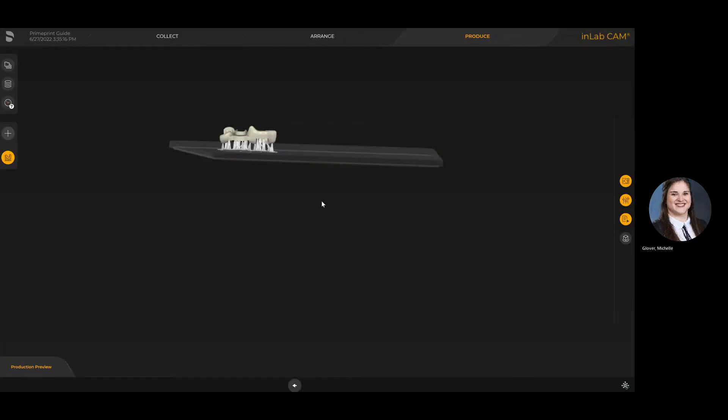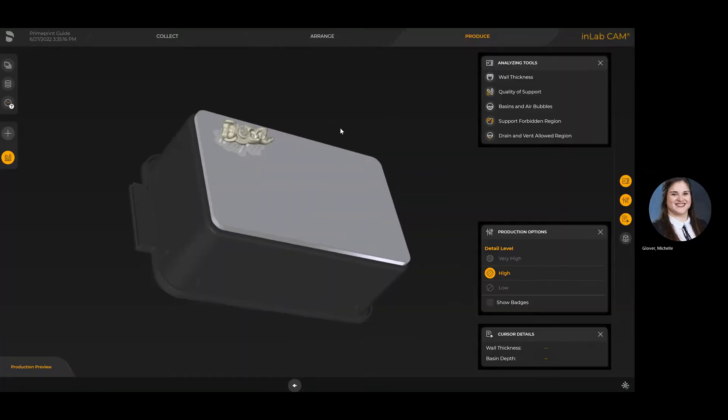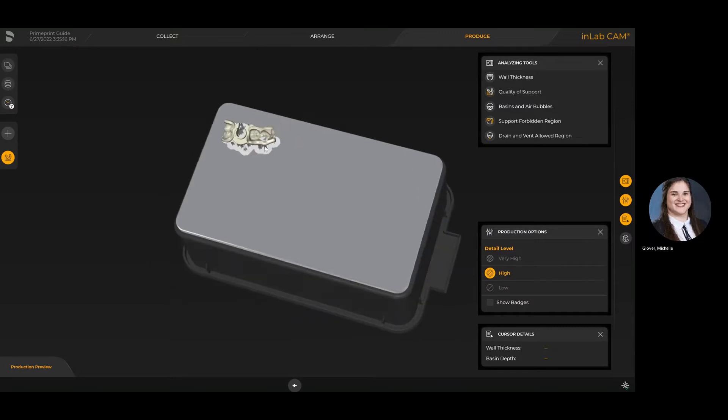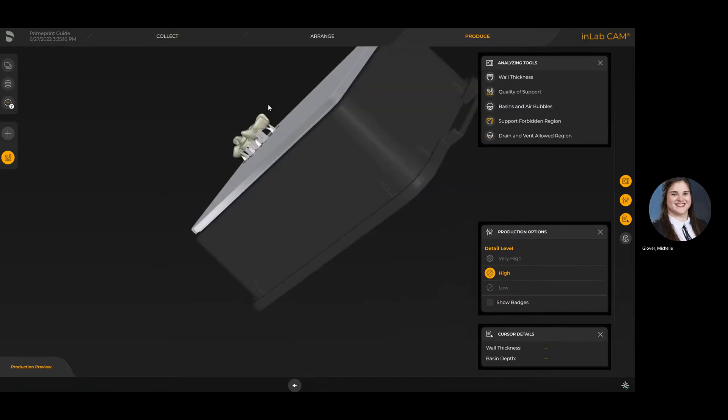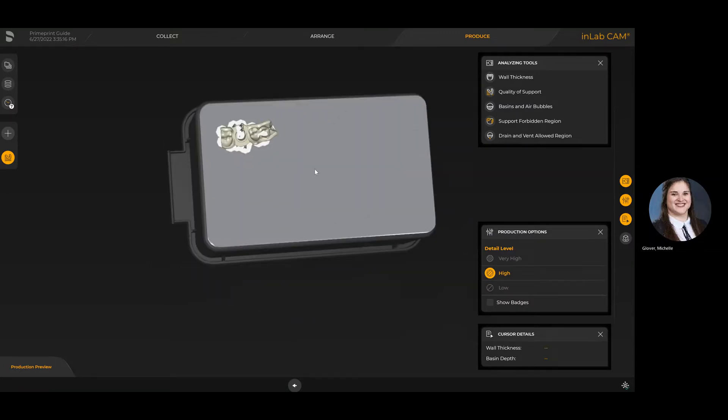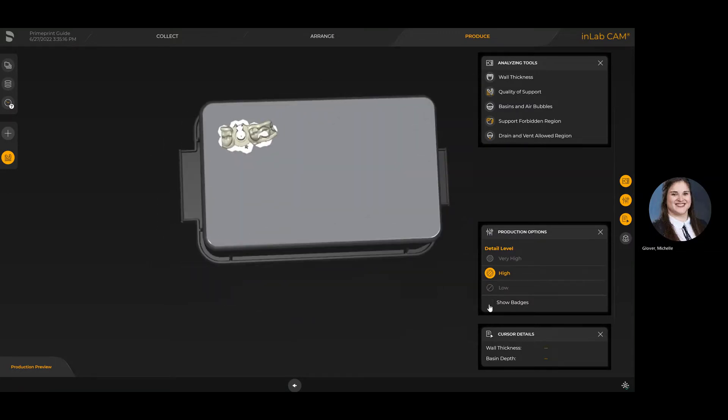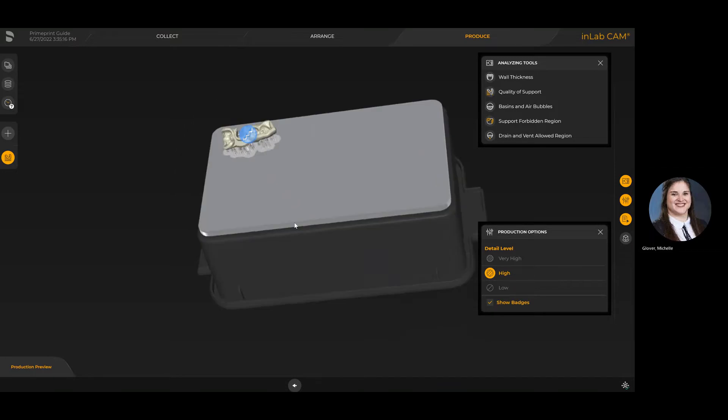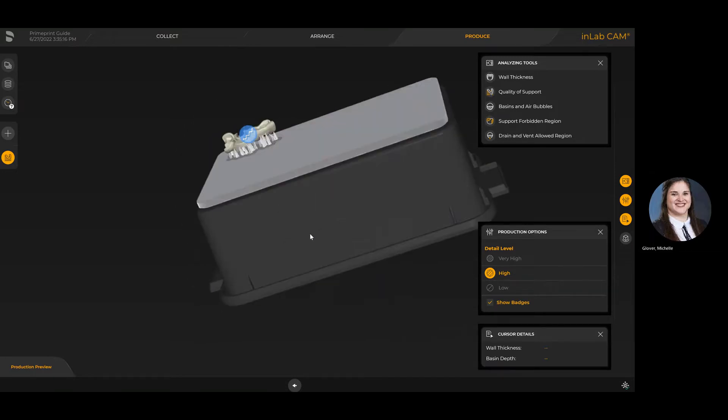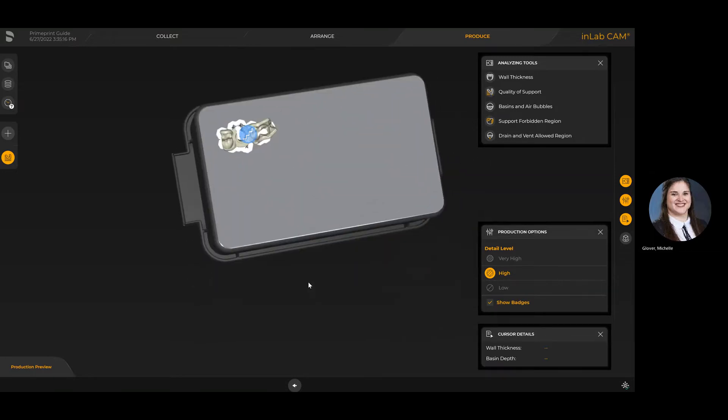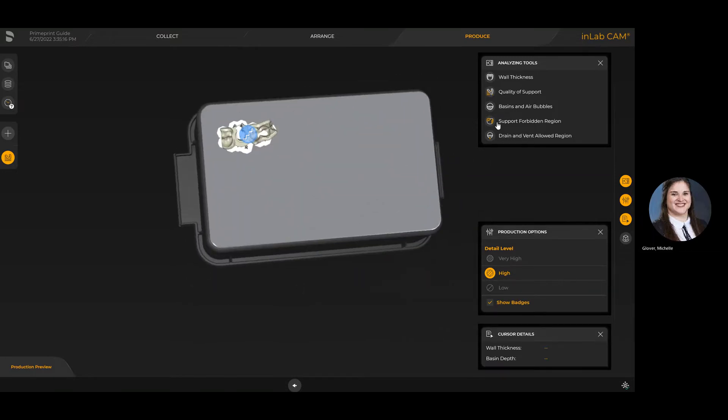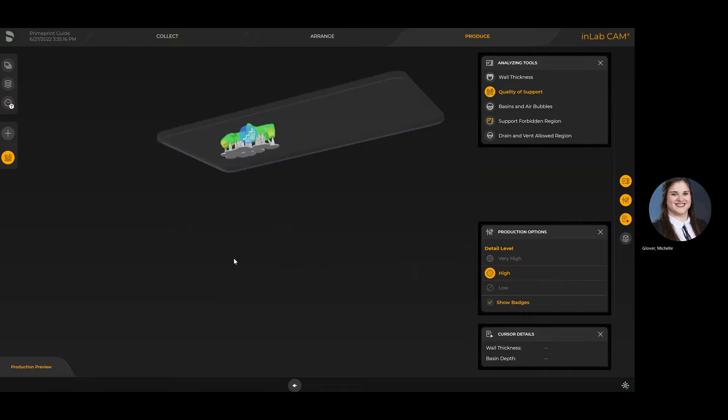You'll see that I'm now directly in the produce stage. If I was connected to a printer at this point in time, I'd essentially be able to hit start and ensure that I have the proper cartridge, material carrier, and Prime print box inserted into the printer itself.